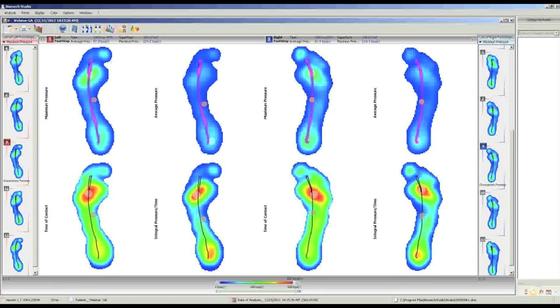This is the first screen you are going to see when you save and display the analysis. On both sides of the screen there are different footprints. Automatically, the software detects among all the footprints analyzed which are the characteristic footsteps — the most repetitive footprints detected. Of all these footprints, it shows the maximum pressure for both the left and right side. The first footprint is the maximum pressure and the second is the average, showing the distribution of maximum and average pressure.